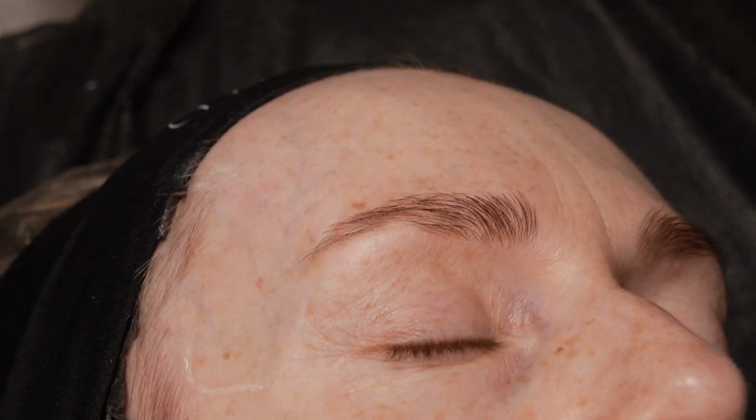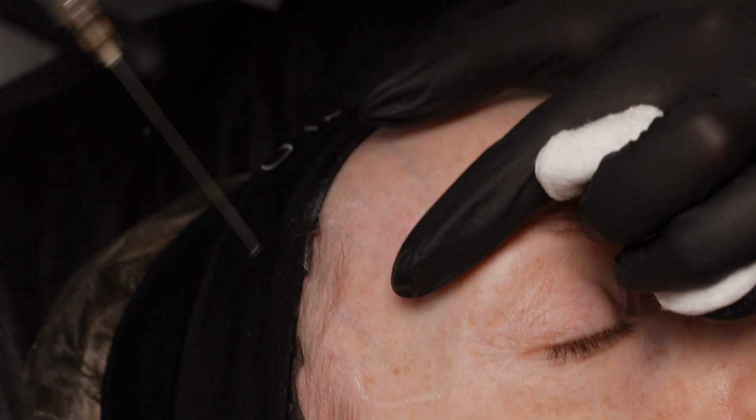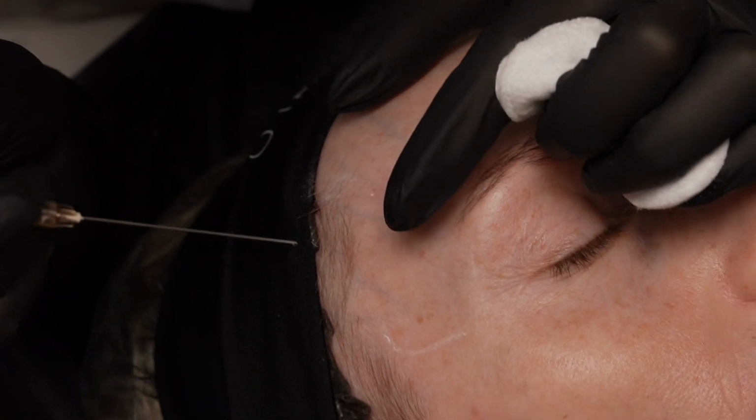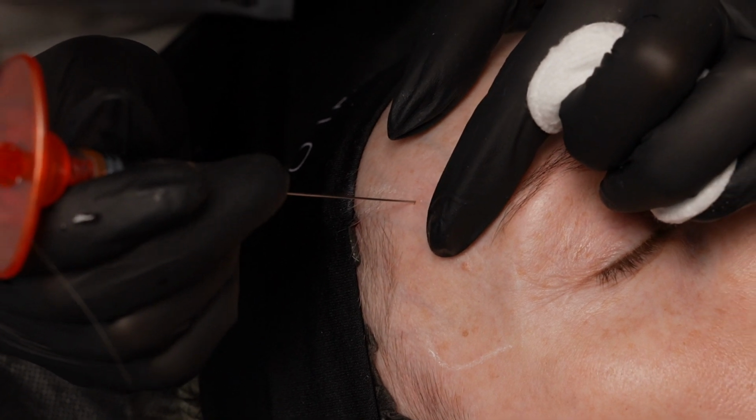Filled, primed. Okay. First 90 degrees. You also touch the bone.